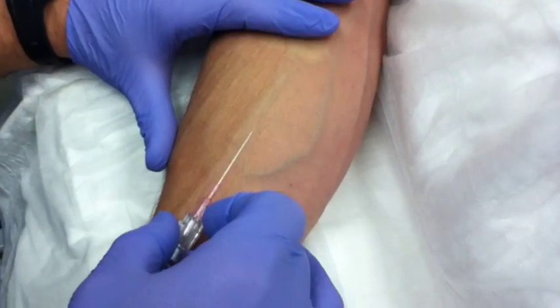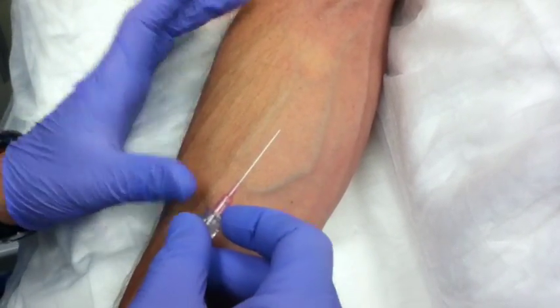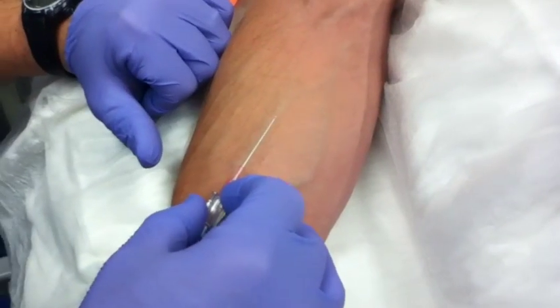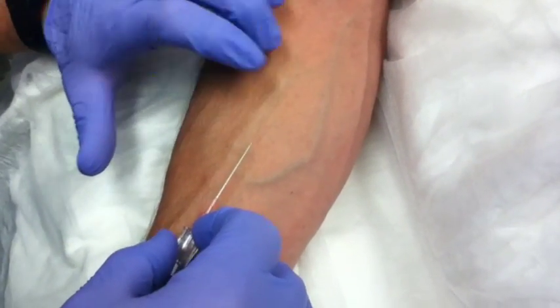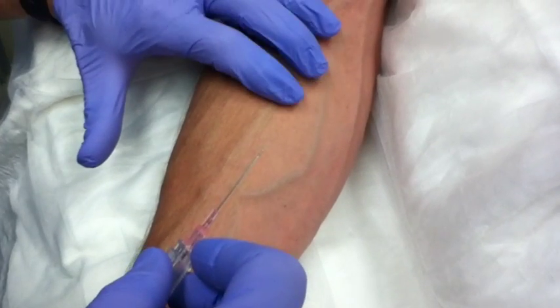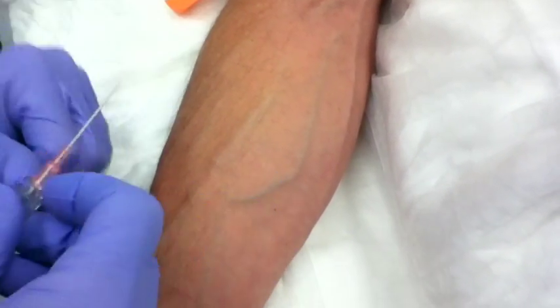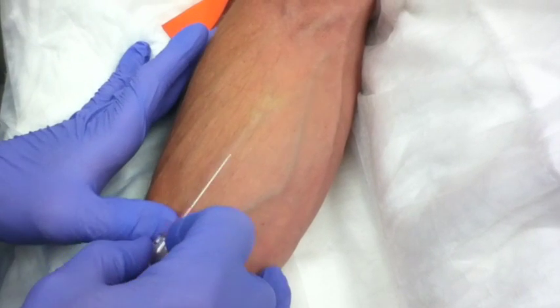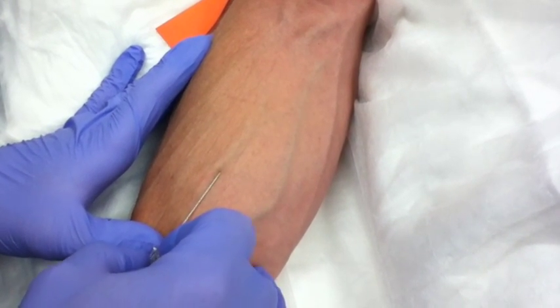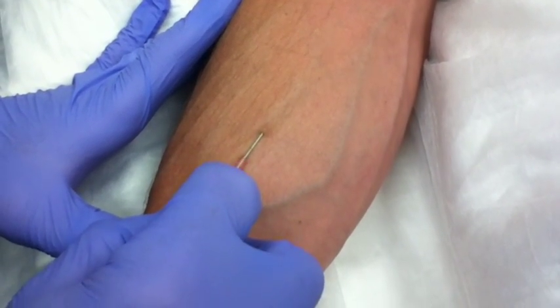I usually go a little bit to the side and then enter the vein. For big veins that are nice and easy, I know there's enough room for the catheter, so my determining factor is making sure I have enough room for where the catheter is going to end up. I have to plan ahead — I'm going to poke down here in this straight section of the vein so there's enough room for it to go. If I can't feel the whole vein all the way up, I might need to back up and go where I can feel it and have the catheter end there. I'll usually count to three and use a quicker technique. Once I get in, I look in my chamber, I'll see a flash, and then I advance just a little bit more before the catheter goes up.